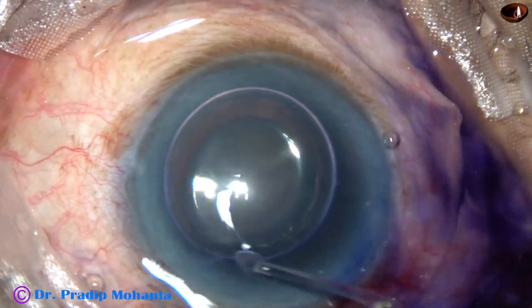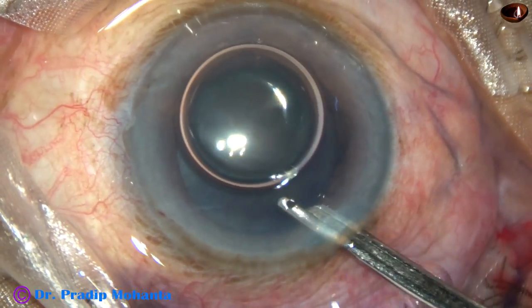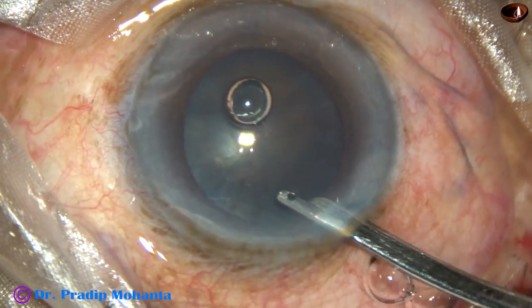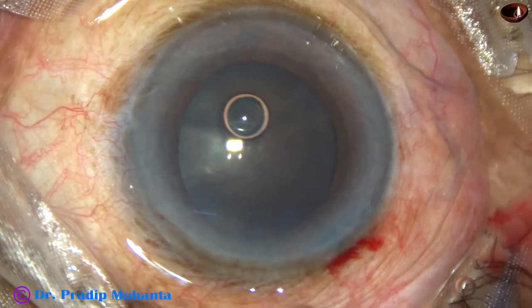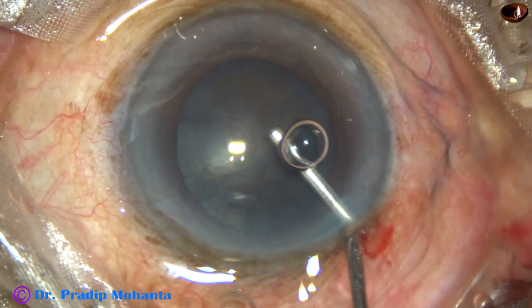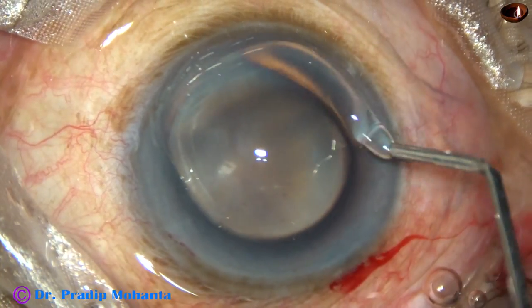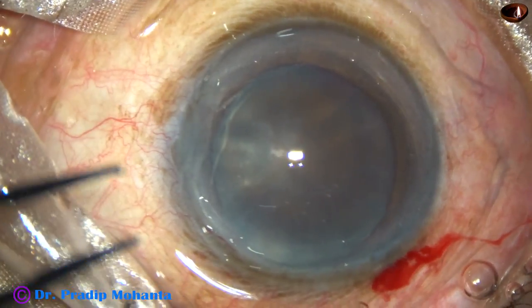A bit of adrenaline has been injected, hoping that the size of the pupil will be maintained. The dye is washed out and then 2% hydroxypropylmethylcellulose is injected to fill the anterior chamber. The methylcellulose has also been applied to the corneal epithelium to get better visibility.